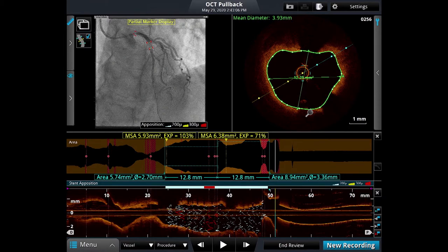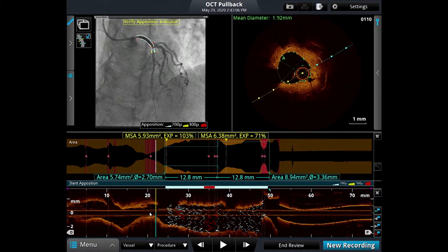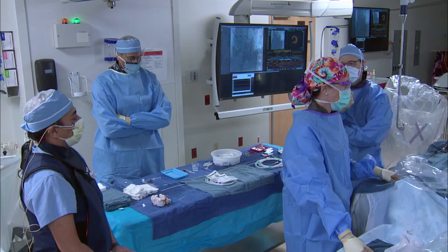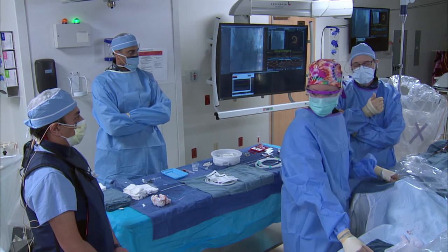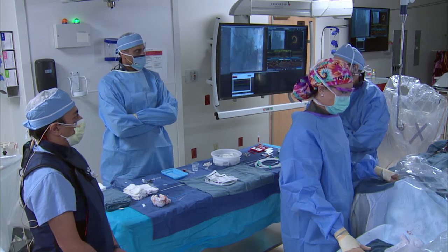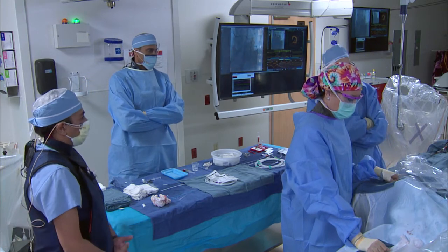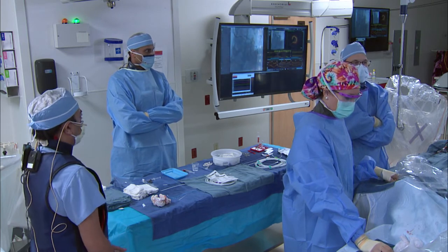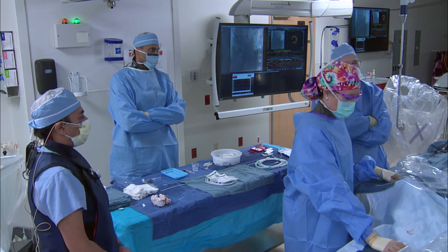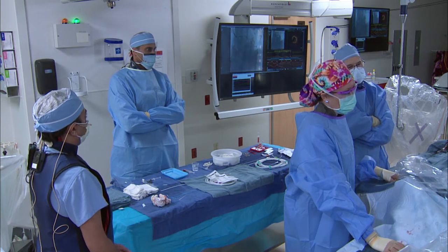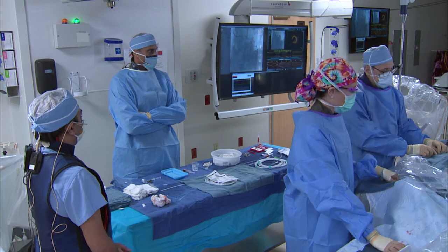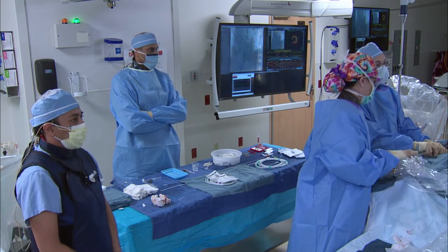Does this OCT information tell us what strategy to use? Am I just going to balloon and go, balloon and stent, use a Wolverine cutting balloon, a scoring device and stent, or atherectomize? Based on Bimal's analysis, using a scoring balloon may be the best approach. I don't think it requires rotational atherectomy based on the fact that it's basically hyperplasia, not atherosclerosis. Trying to get nice plaque modification with the Wolverine cutting balloon may give the best bang for your buck.